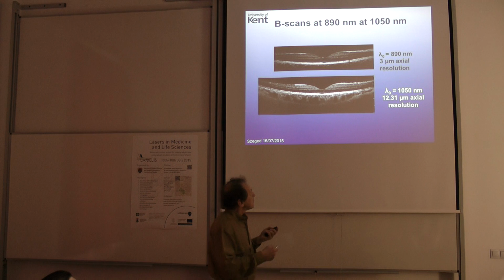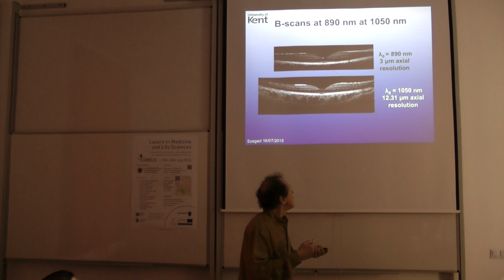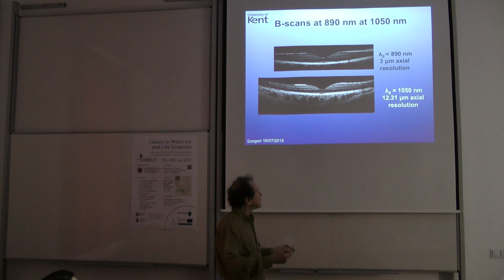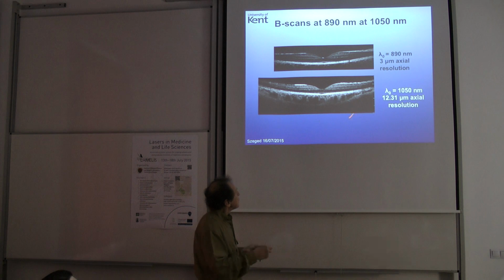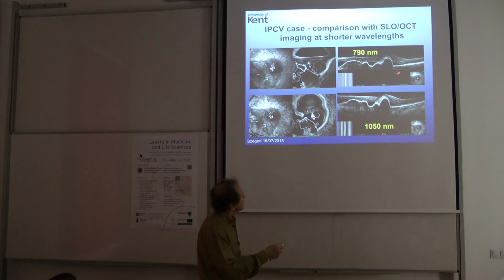And now this is an example of our work on broadband sources, and there is already a commercial company selling tunable laser systems working at 1050, putting together both this fantastic fast spectral domain modality together with the penetration depths allowed by the wavelengths of 1 micron. And here more is our old technology of time domain producing SLO and OCT, scanning laser ophthalmoscope and OCT. And again, you can compare here the penetration depths, much better here than here.